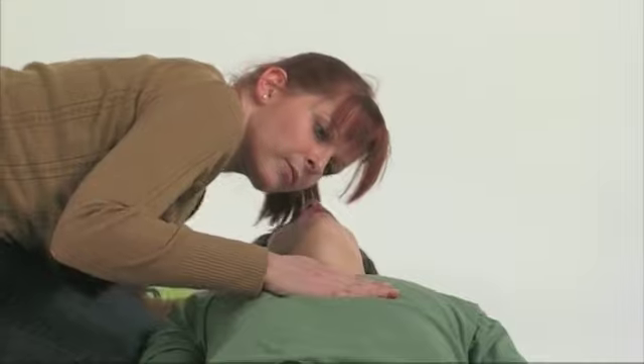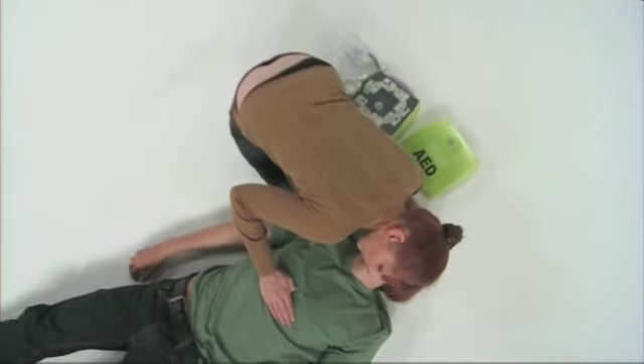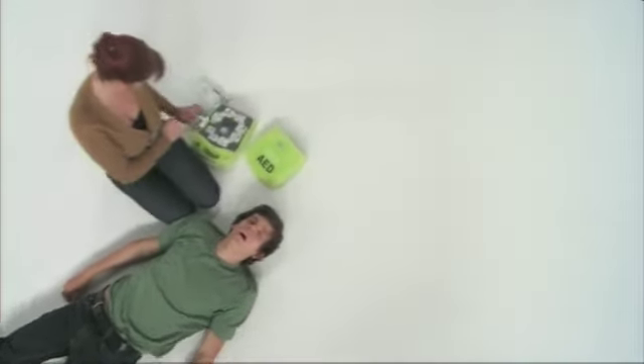If the patient is conscious or they are breathing normally, do not continue to use the AED+. If you are in doubt, however, continue on and apply the electrodes to the patient.